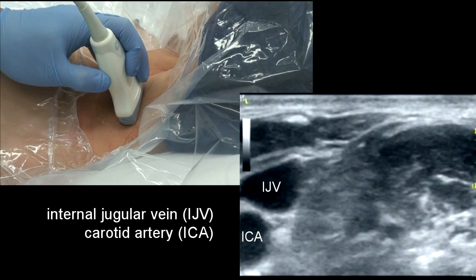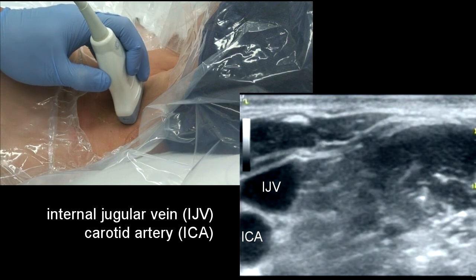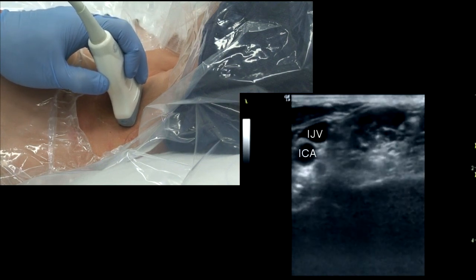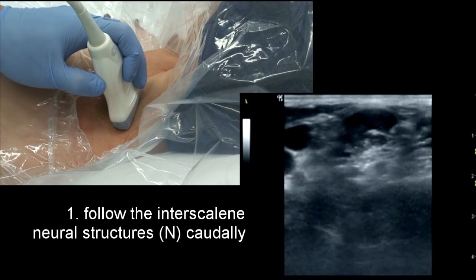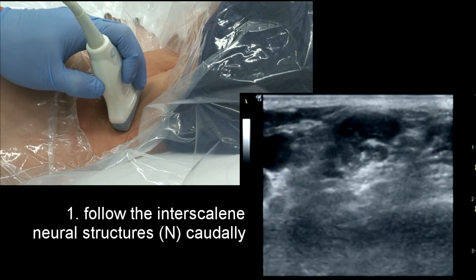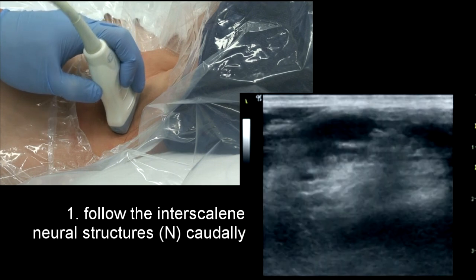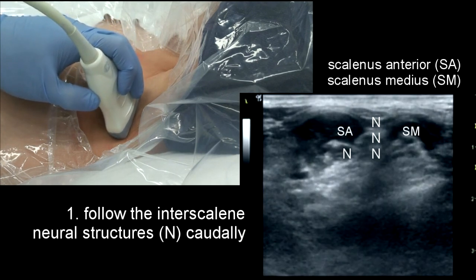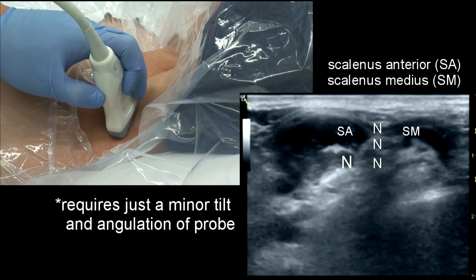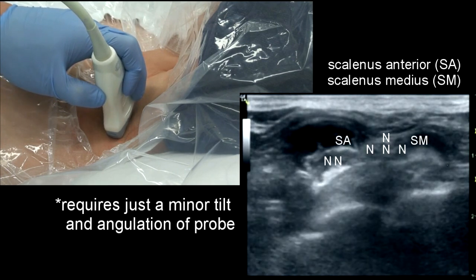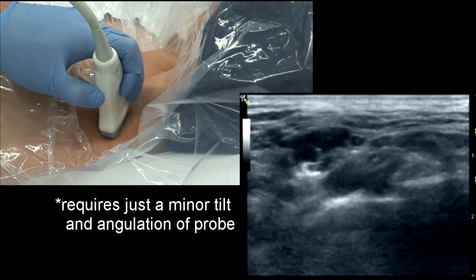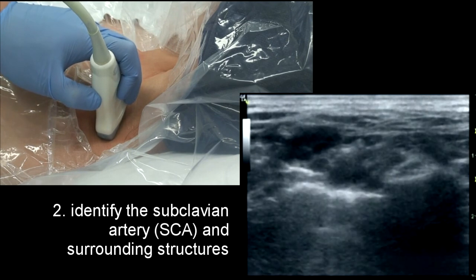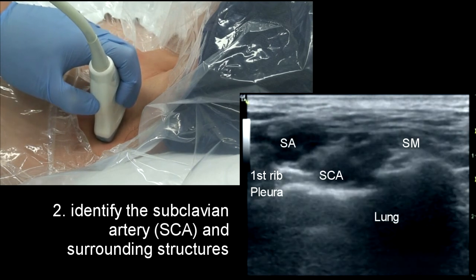As for an interscalene block, first identify the medial anatomy. Once the interscalene brachial trunks are found, follow them caudally. This requires just a subtle movement of the probe. Watch the nerves diverge to form the classic supraclavicular view.